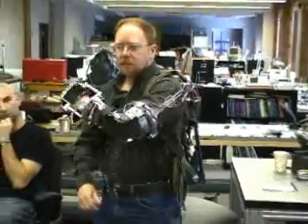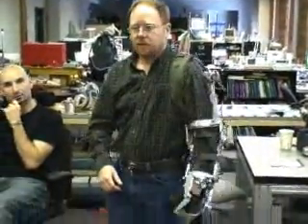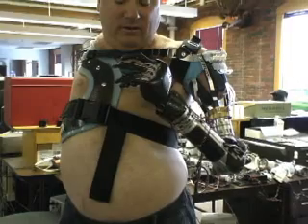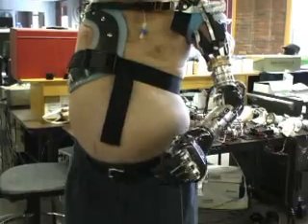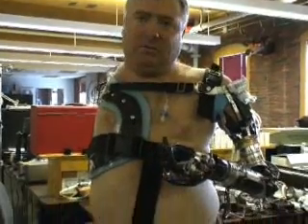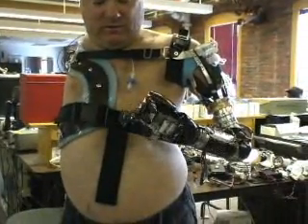The electronics support a variety of inputs. Depending on the user, the arm can be controlled by nerves, muscles, or even foot pedals. In the demonstration, pushing on the little toe moves the arm down, while a muscle site switch changes the mode so that pushing on the ball of the foot rotates the wrist, and pushing on the outside rotates it the other direction.